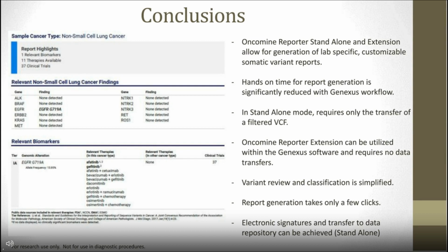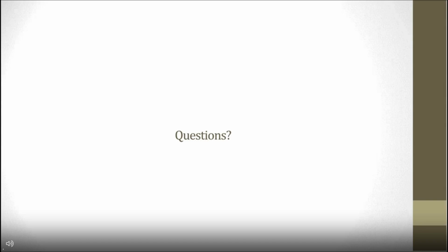So overall, we find that the workflow, whether standalone or integrated, has presented us with a much better, smoother workflow for our laboratory operation. And with that, I'd like to conclude my discussion of the Oncomine Reporter software and its usage within our laboratory at Sentara, and I'd be happy to address any questions that you have. And again, thank you for your time.